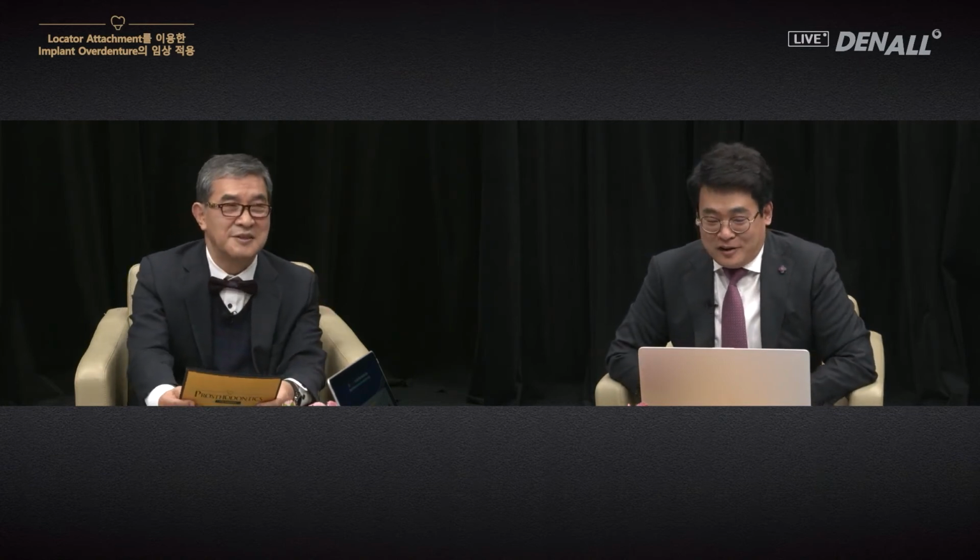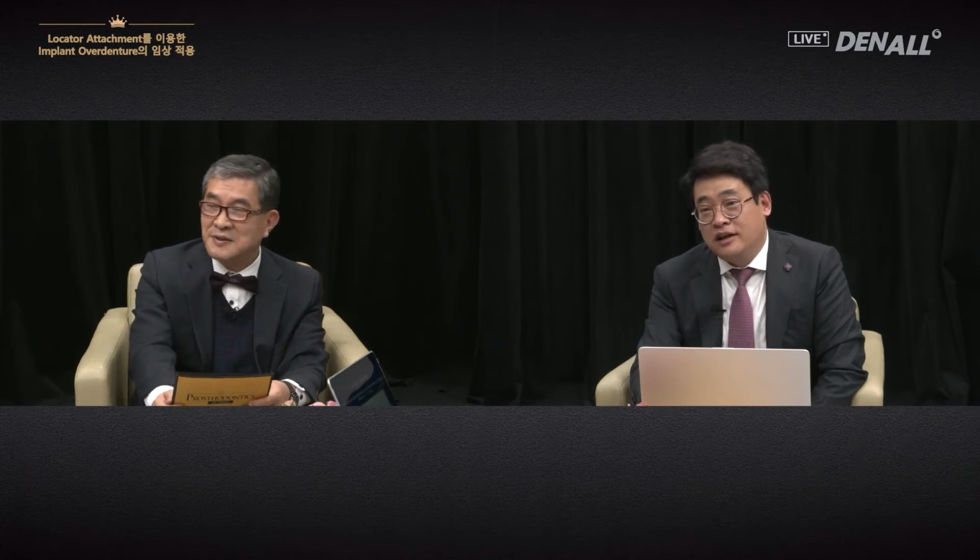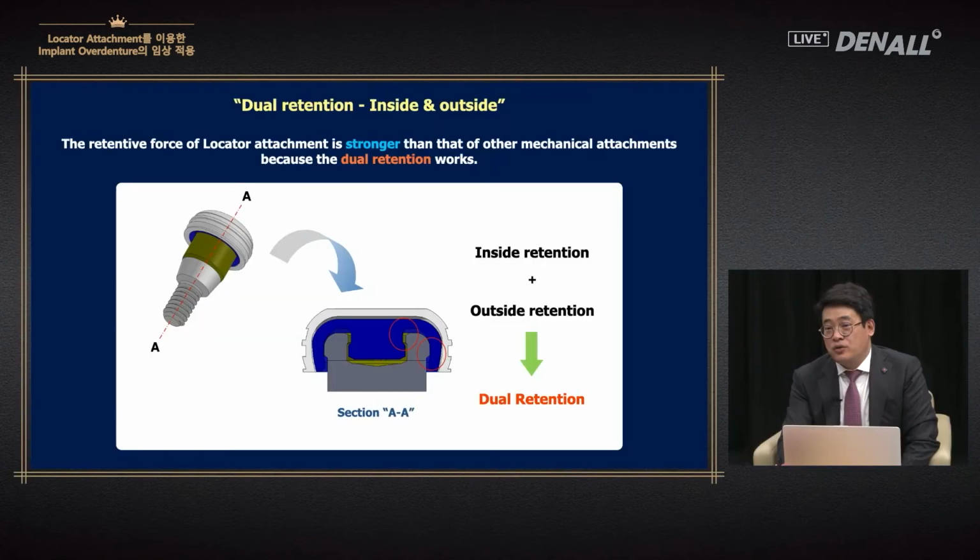What should be a removable prosthesis turns into fixed. One time the patient came in because the patient was unable to remove it for a week. The patient used the pink. Even if you try to remove it, yes, you and I have the same experience. Because the locator has dual retention method, its retentive force is very strong.